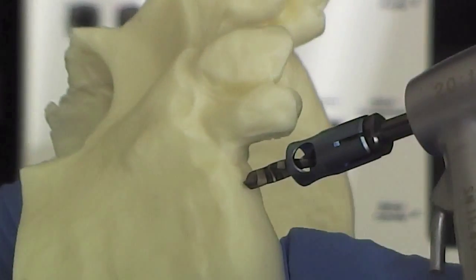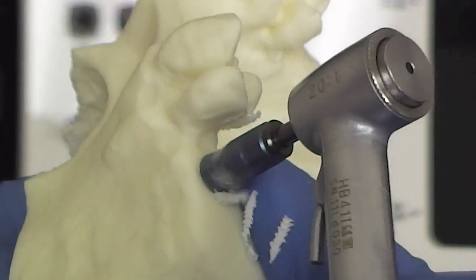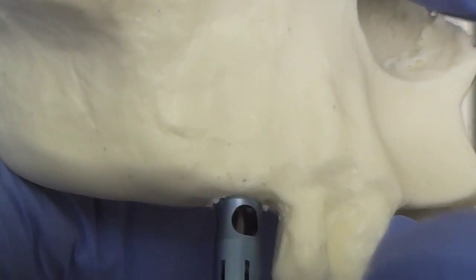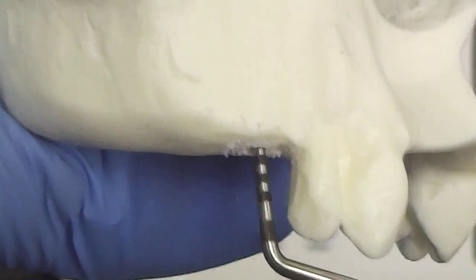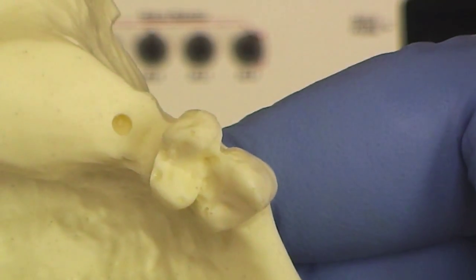We're going to begin our osteotomy in the second premolar region. I'm going to try to center it and use the suitable appropriate angulation. And we have the beginning of our 2 millimeter osteotomy here to a depth of 7 millimeters. Again, our stopper prevents us from going any deeper. We're going to check the depth with the sinus probe, and we still have not elevated it yet. So, as you can see, we've started our osteotomy pretty well centered.